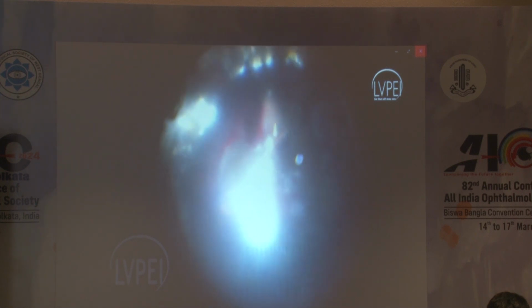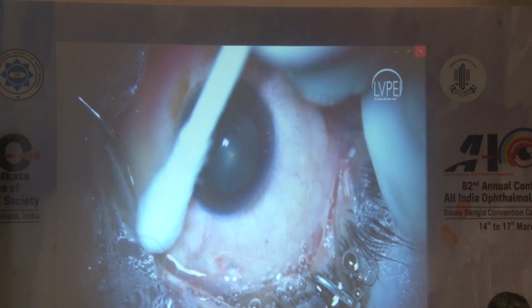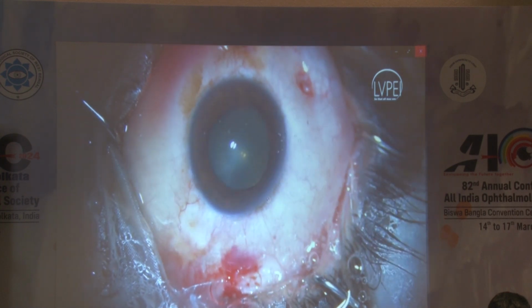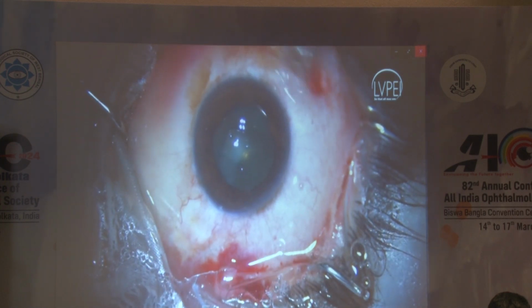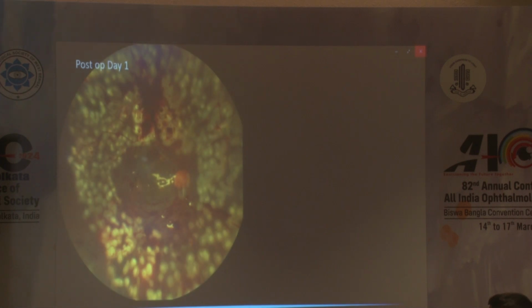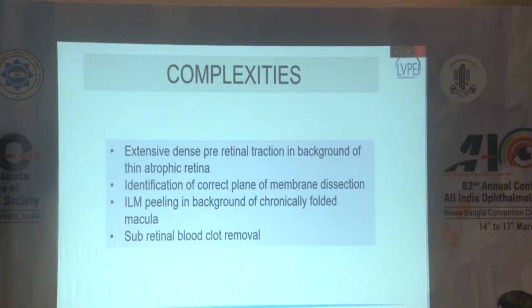Silicone oil injection of 1000 centistokes was done. Ports were then closed, followed by povidone iodine wash. On post-operative day 1, the retina was attached under oil with 360 degree laser marks. His visual acuity after 6 months was 20/100 after silicone oil removal, with attached retina.